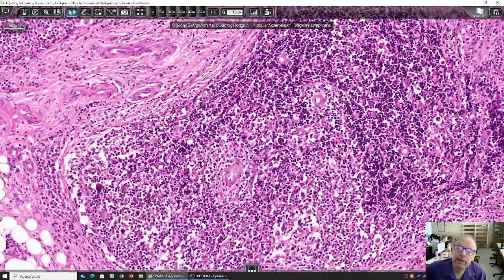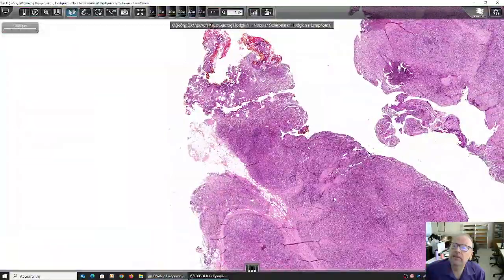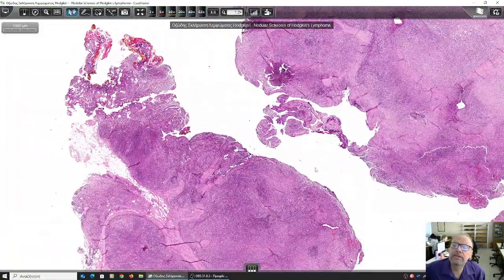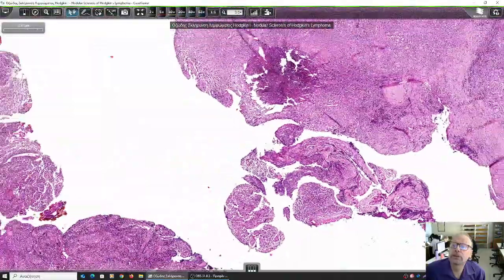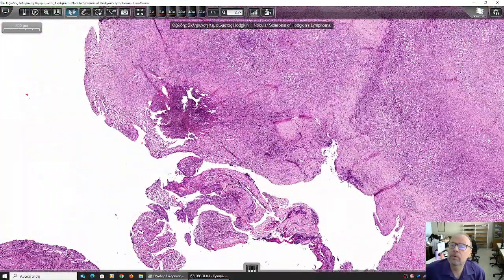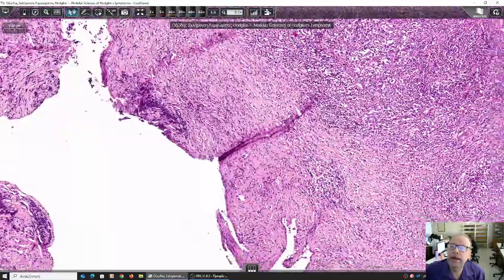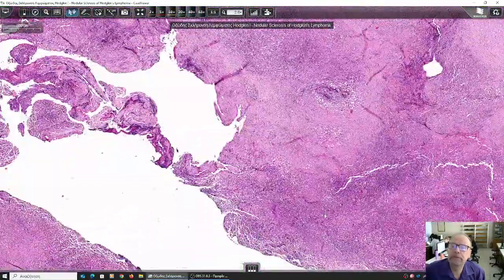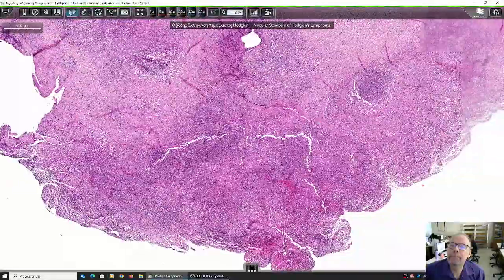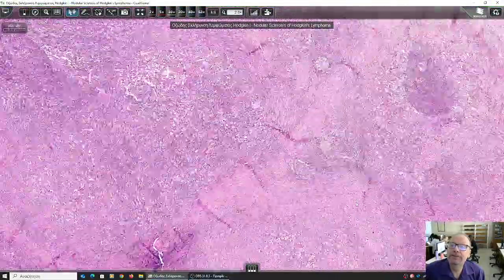No, I can see here. I can see the malignant lacunar giant cells. But in this section, I'm afraid I cannot see what I wanted to ask you. Perhaps, just a moment, because it's something. I found it.